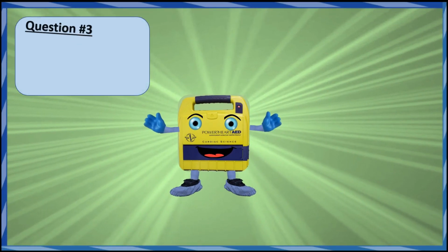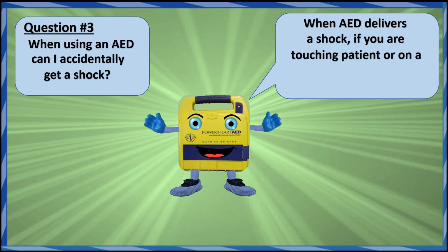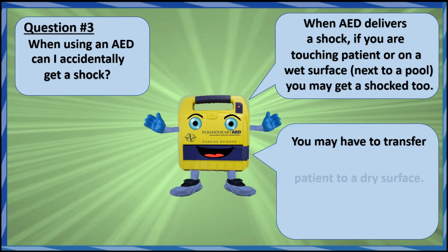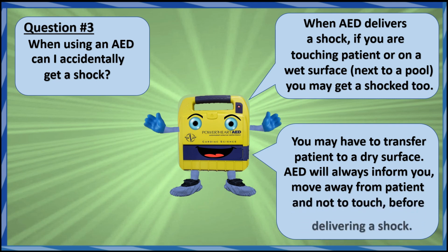Question number 3. When using an AED, can I accidentally get a shock? When AED delivers a shock, if you are touching patient or on a wet surface next to a pool, you may get a shock too. You may have to transfer a patient to a dry surface. AED will always inform you to move away from the patient and not to touch before delivering a shock.